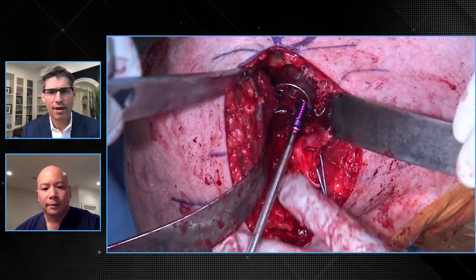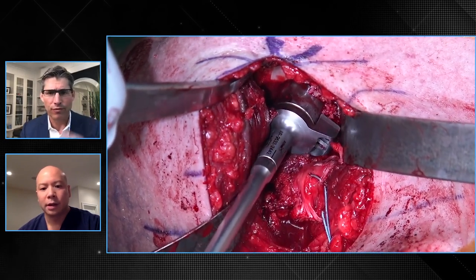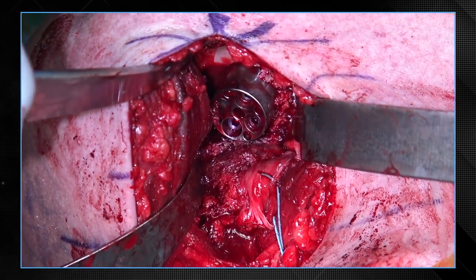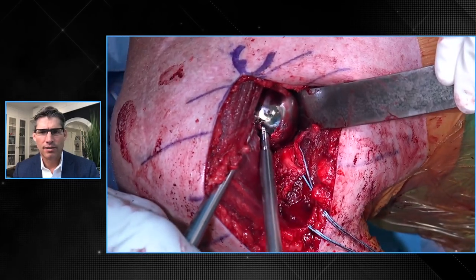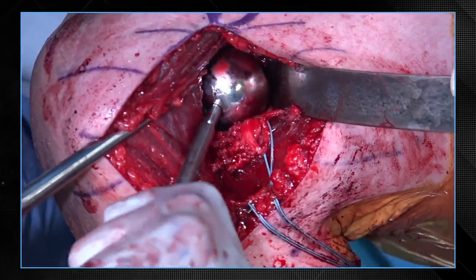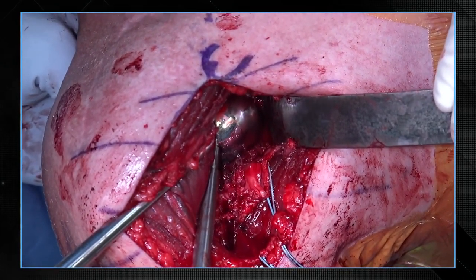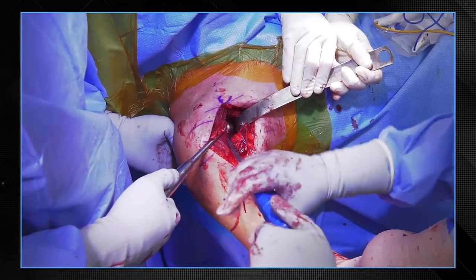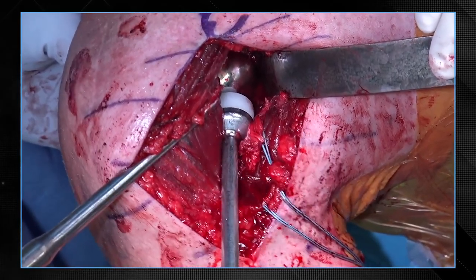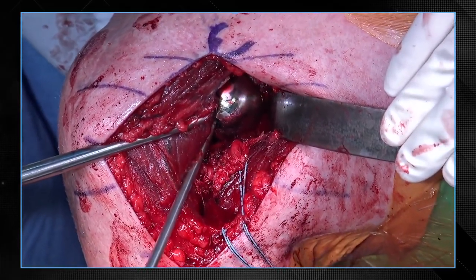It looks like you're putting all four screws in — the VIP already knew what the length was, so that makes it easy for your tech; they're ready to go and your rep's got the right screws in the room. Now it looks like you're taking away peripheral bone. Yep, this is just to make sure there's nothing that will hang up the glenosphere. This tool is also useful to double-check the size of the glenosphere. This is the glenosphere handle here. Sometimes in these large individuals you can't have all the retractors in, so we're using a bone hook to retract the humerus out of the way. The inserter for this glenosphere is excellent — it's threaded in, so if it's a tight space it allows you to get in there without worrying that the glenosphere is going to disengage. Now we're impacting it in. The nice thing about this system is that the Morse taper, when engaged, the central screw will lock into this mechanism. The central screw will not go in if it's not engaged — that's the worst when you get your post-op x-ray and the glenosphere is a little bit off the Morse taper.